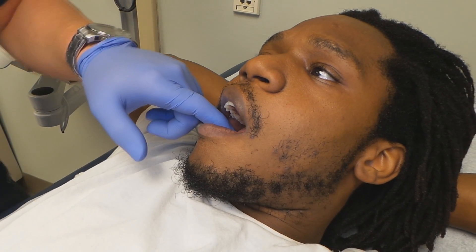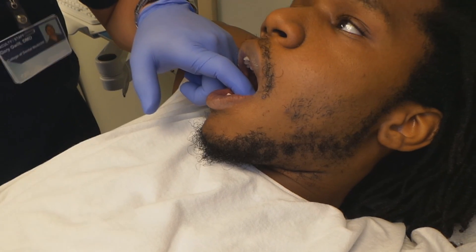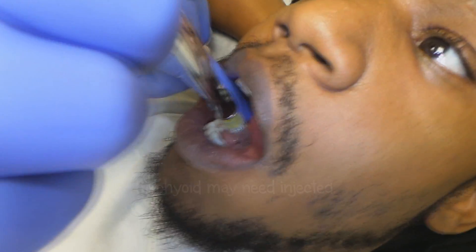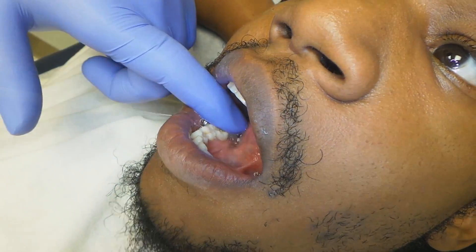Rarely — hypothetically, if you can't get a patient numb — sometimes it's the mylohyoid. Very rarely, about 2% of patients have an innervation from the mylohyoid. You're just going to take the needle, drop it straight down to the floor of mouth. Obviously you're going to aspirate to check for positive aspiration, then deposit a little anesthetic.